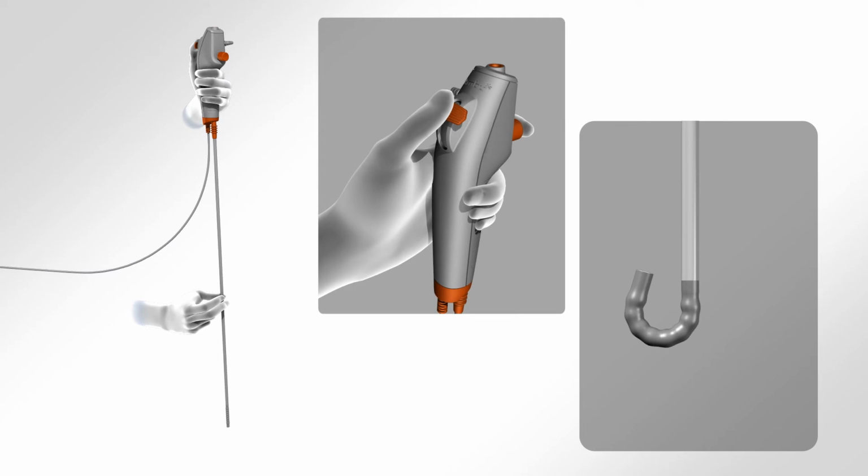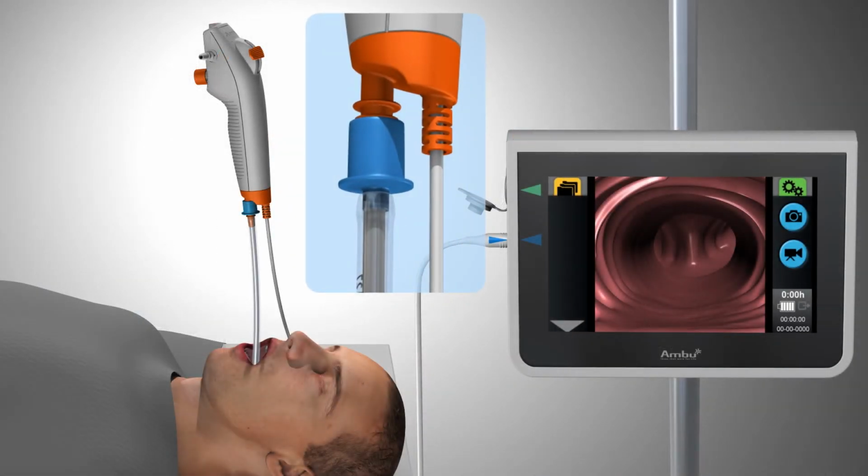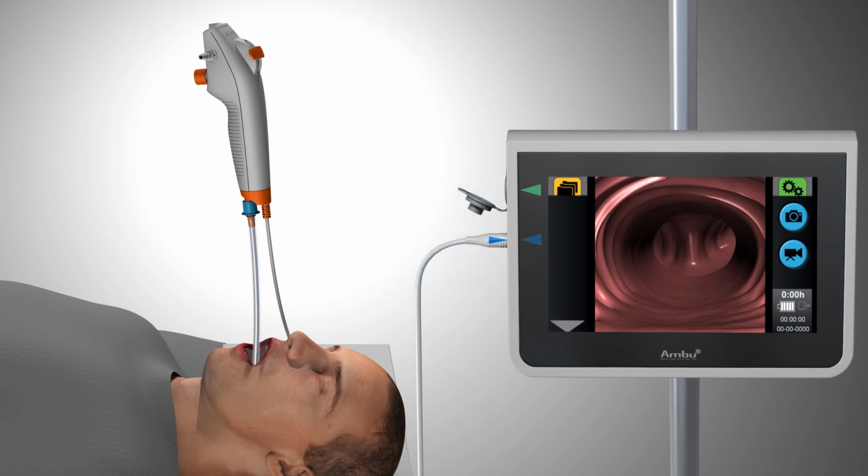If the camera image becomes unclear, the tip can be cleaned by gently rubbing it against the mucosal wall. Once the tracheal rings are visualized with the aScope, detach the ET tube from the tube connection and advance along the insertion cord into the airway.